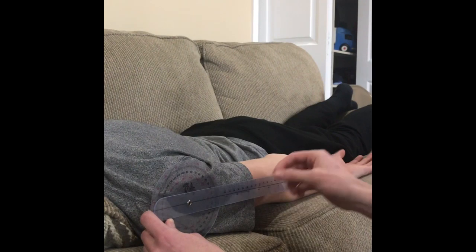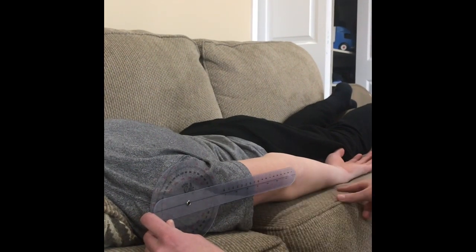All right, so now we're going to be measuring the shoulder extension of a patient. So very similar to the shoulder flexion, your movement arm is going to be lining up with the humerus, and your stationary arm is going to be lining up with the table, making sure it's parallel.